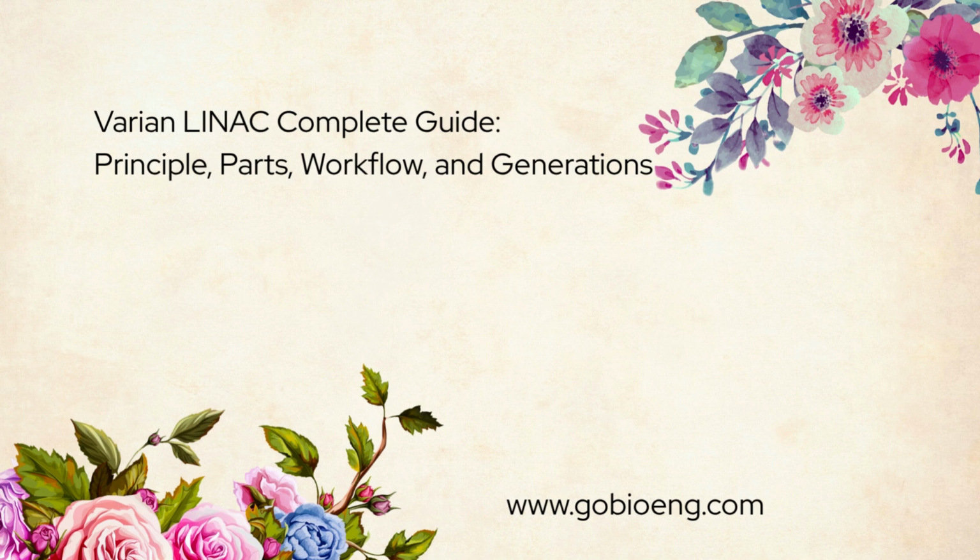This is why radiotherapy engineering sits at the intersection of biomedical engineering, electronics, mechanical systems, software, physics, and patient care. One clear way to understand a LINAC is to follow the beam chain. The electron gun produces electrons. The RF system supplies energy. The waveguide accelerates the electrons. The bending magnet directs the beam, and the target produces X-rays in photon mode.